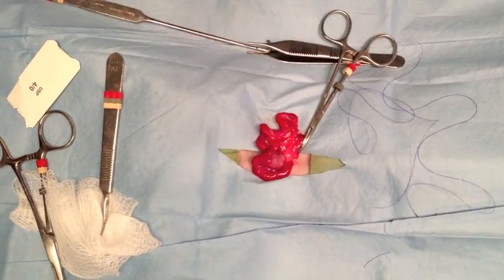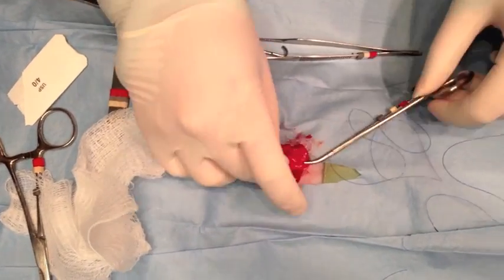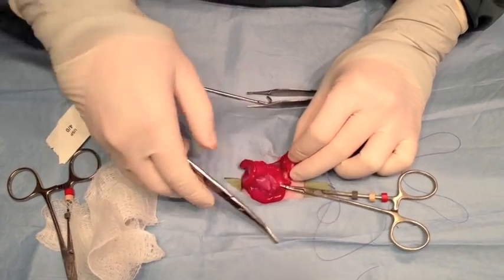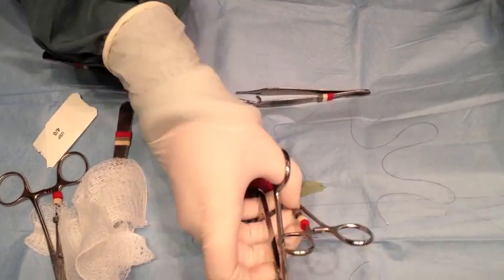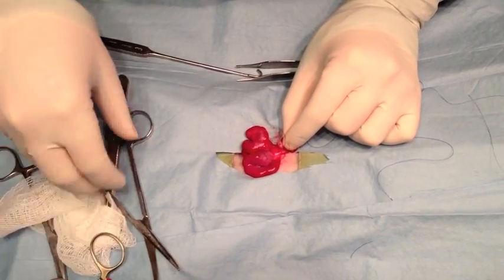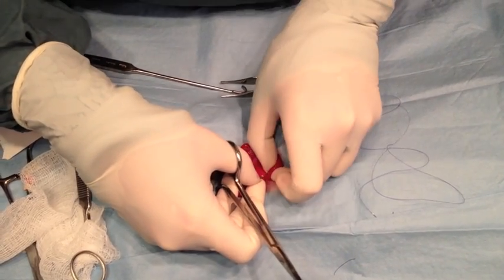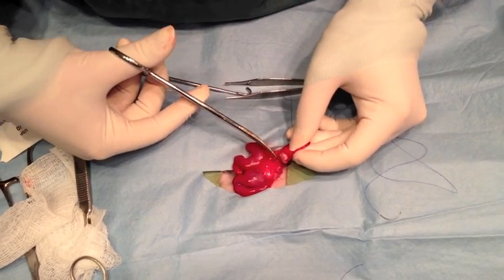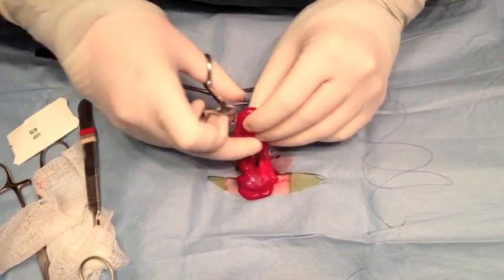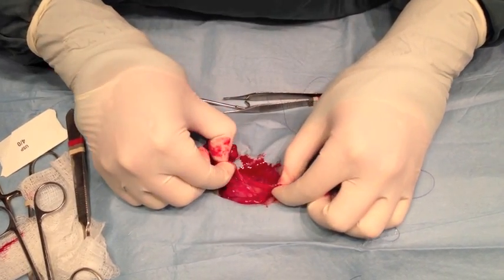For this bunny I'm doing just one ligature on everything — one ligature is sufficient — using pretty small 4-0 suture. Now that I've got those two areas ligated, I'm going to cut right above my ligature on each one, making sure I'm removing the ovary and the oviduct, and then cut the vessels in the broad ligament right above where I ligated them. You have to be careful because you're working with very small areas. There's the ovary — here I am cutting above my ligature in the broad ligament, separating tissue and reflecting back the ovary.